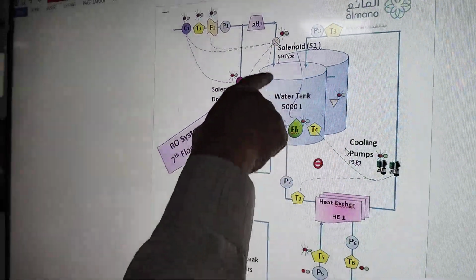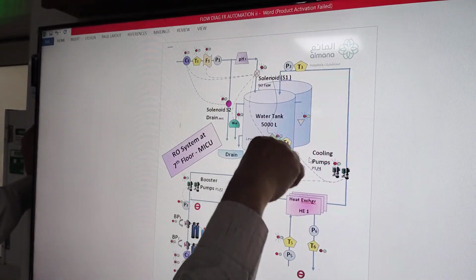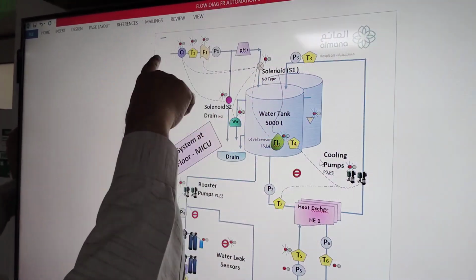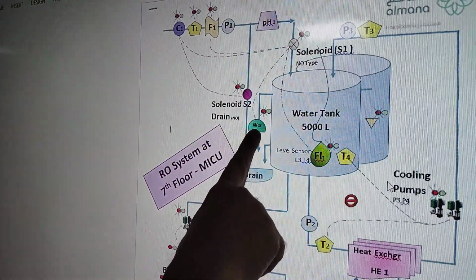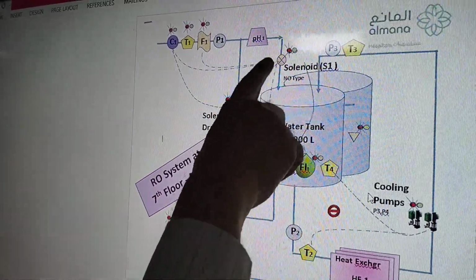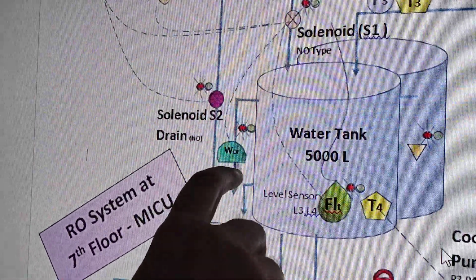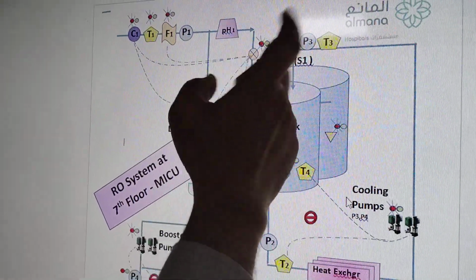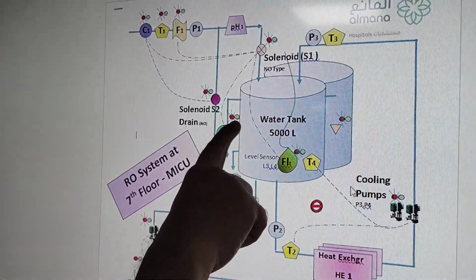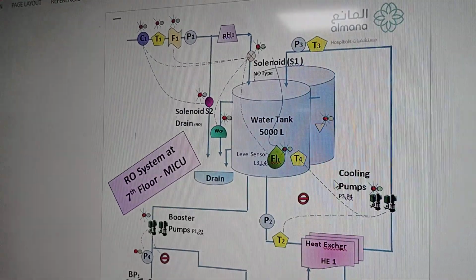These three conditions are also connected to the solenoid. These lines show the connection from the sensor to the solenoid valve. And then there is a water overflow sensor. Suppose there is any leak in the solenoid or the water is overflowing, then it will detect it and switch off this solenoid. And it will give an alarm whenever there is a water overflow. If it is filling beyond the limit, then it will give an alarm.